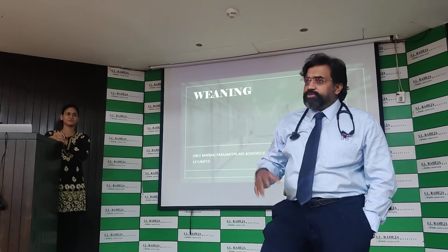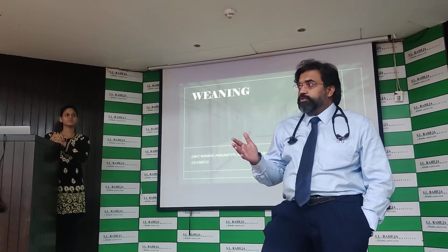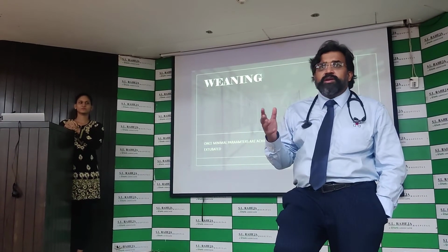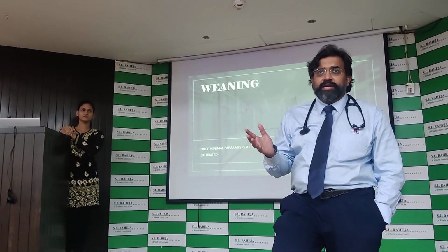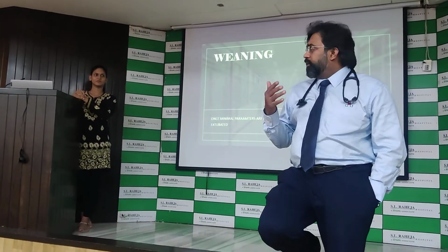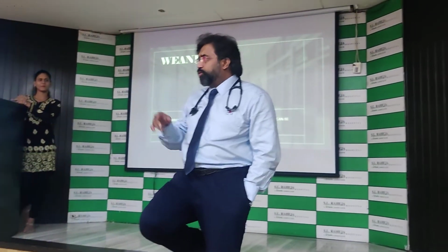Right? To set the PEEP and the FiO2, this particular bazooka ventilator also has a PV curve, a PV tool. You can actually figure out what the optimal PEEP is. It doesn't have the FRC. Each of these ventilators has some yes, some no, it's like that. But this has got the PV loop. So sometime later, if that patient is on top, I can show you how to do the PV loop on that particular ventilator. Okay?